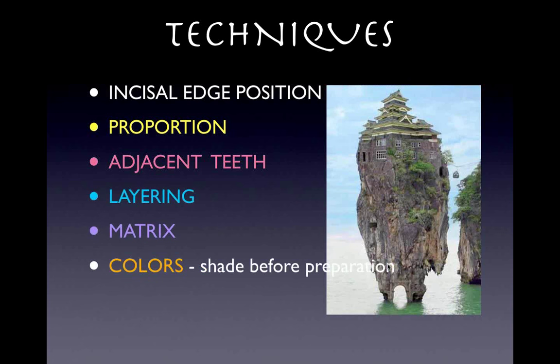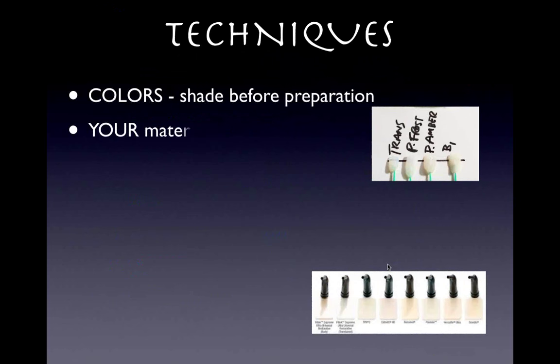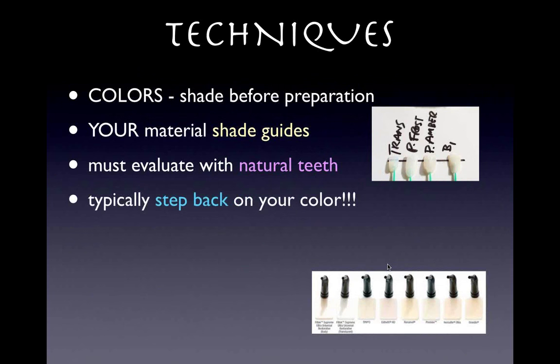And then the colors, the shades before preparation. We want to look at the enamel shade, the dentin shade, and try to evaluate that. But again, I like using my own shade guides because the shade guides from the companies may not really match exactly the material that you're using. The other part is the colors before you prepare: make materials from your shade guides and evaluate them with the natural teeth. Take the photographs. I recommend always taking photographs with a regular SLR camera. It really gives you a good idea. You'll see some of the photos today, how they really depict back the real color, so you get a sense of what you're doing.